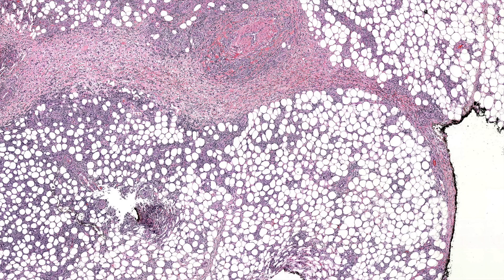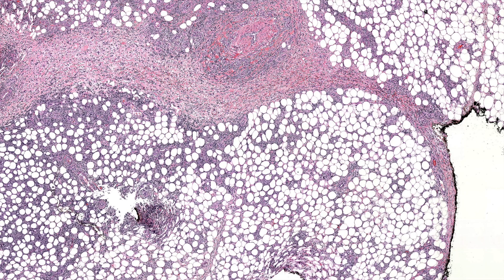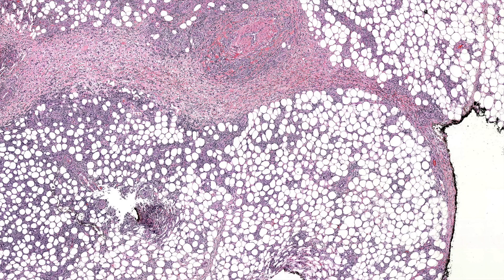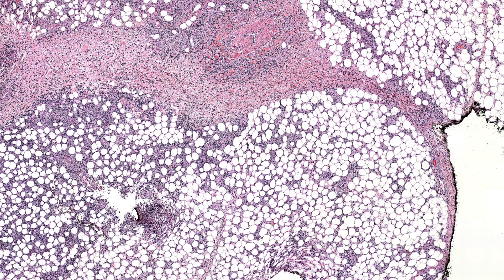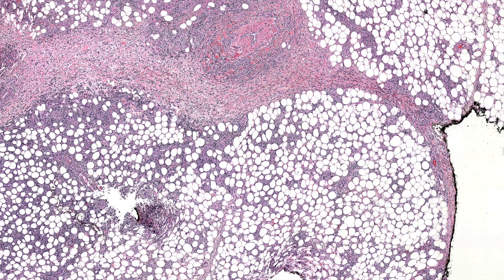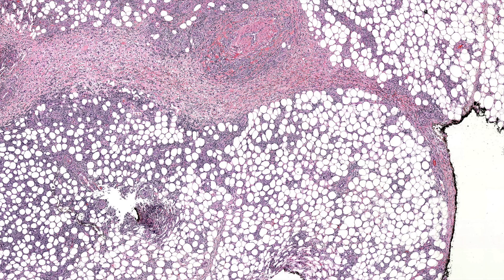The things that would favor paniculitic T-cell lymphoma are lymphocyte atypia, adipocyte rimming by cytotoxic alpha-beta T-cells, which are usually going to be positive for beta-F1, CD3, CD8, and TIA1, and then they'll be negative for CD4 and CD56. So those are the things that will help you identify paniculitic alpha-beta T-cell lymphoma.